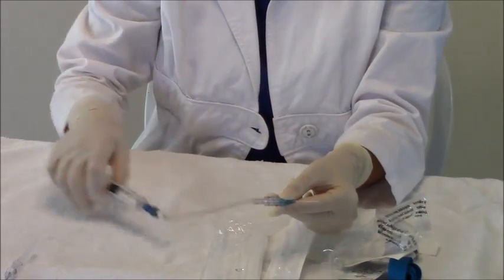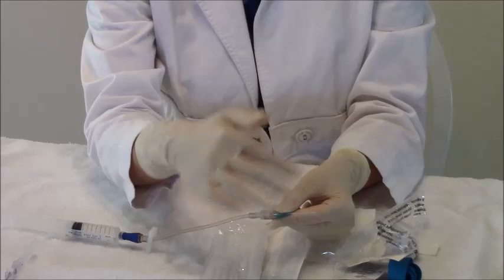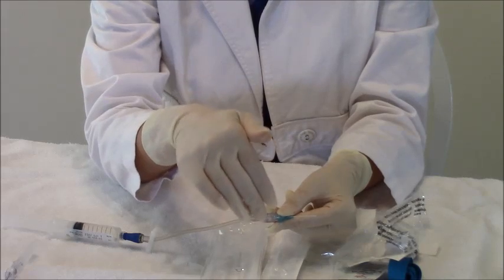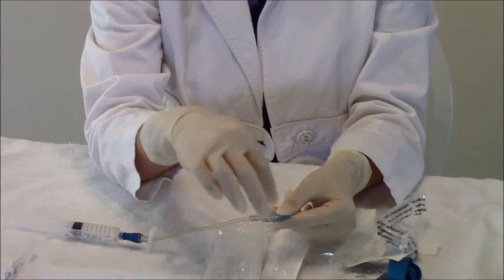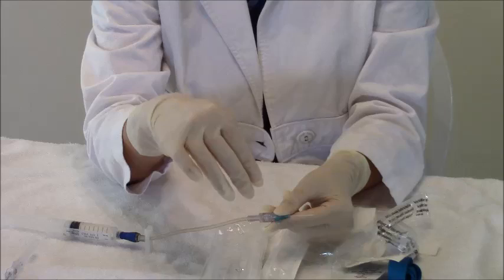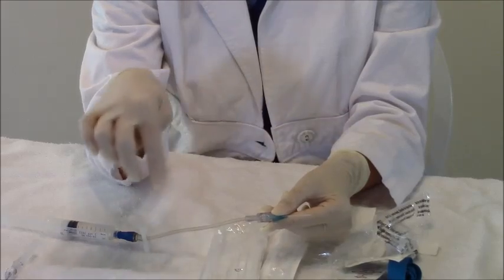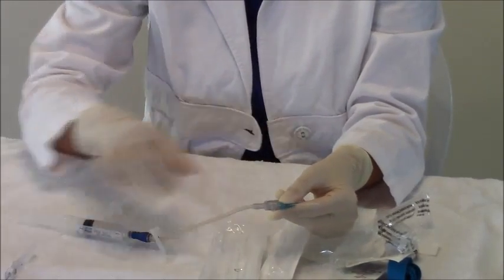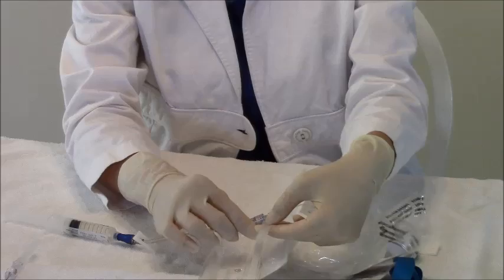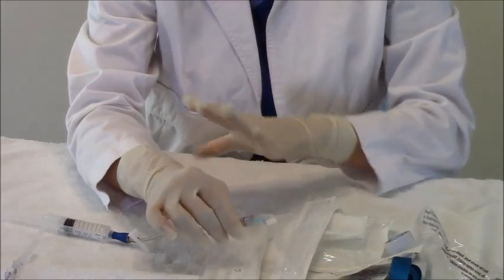Once your IV is in the vein, this little straw will sit in the vein. You'll have blood coming out and you'll want to hold compression right there. Take your IV extension that you primed and screw it right on there. Make sure you get it very tight because if you don't, blood will leak out. Once connected, flush some saline — you can see it going into their vein. Feel around the site to make sure it doesn't bubble up. If the patient says it hurts or stings, that's normally not a good sign because the saline is going into surrounding tissues and it's infiltrated, so you'll want to take it out. If the patient says it feels cool, like something's dripping down their arm, or they can taste or smell something, that's generally a good sign because your saline is in the system, in the vein.